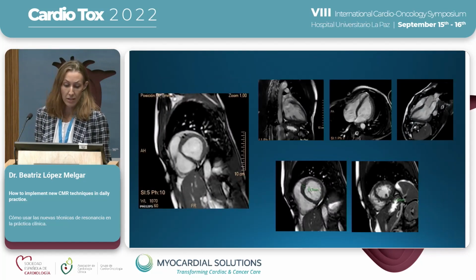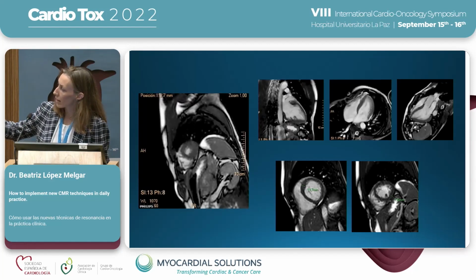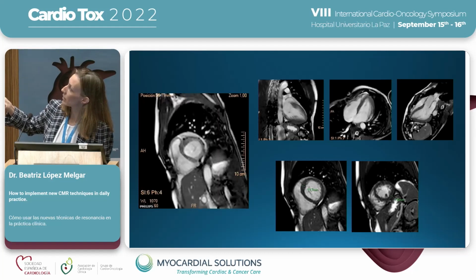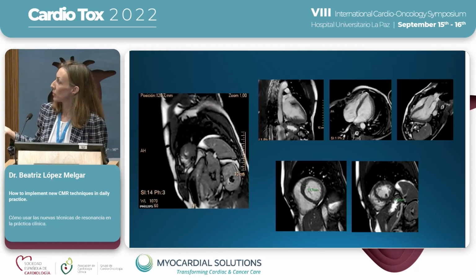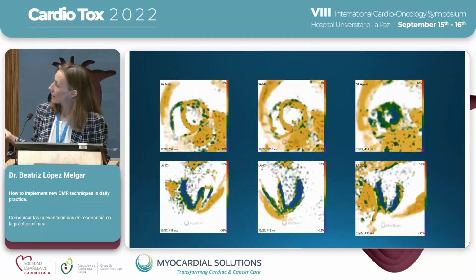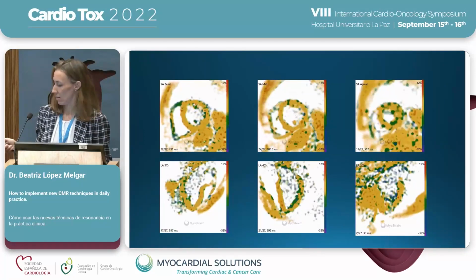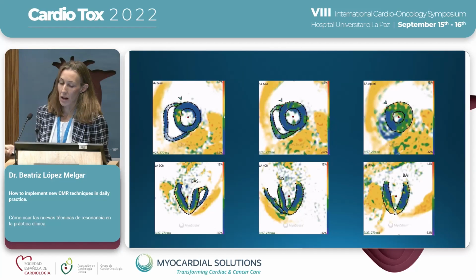These are the cine images, as you can see. There was a very mild hypertrophy in the basal septum, 12 millimeters, but maybe here in the apical lateral, the apical inferior and inferior basal there are some alterations, but when you measure this thickness, everything was normal. So we did a myostrain and confirmed that, look here, the apex was contracting with abnormalities. Here, you see. And also in the basal septum, where we already saw mild hypertrophy.